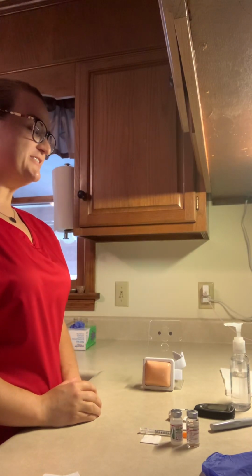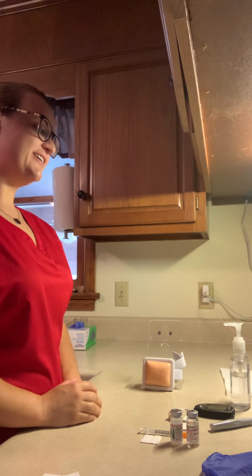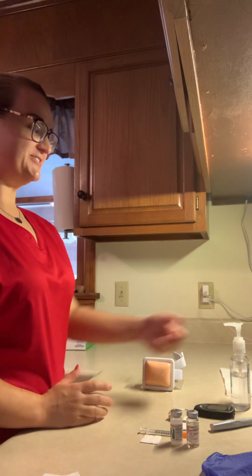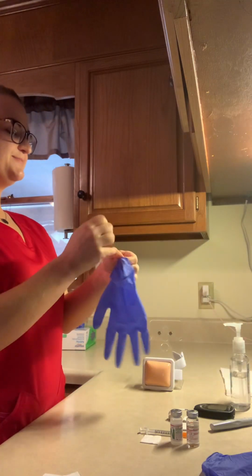Mr. Johnson, my name is Colton. Dr. Smith has given us an order to check your blood sugar and give you a shot of insulin. Do you mind verifying your name and date of birth for me? Great. So to get started, I'm going to wash my hands and put on a fresh pair of gloves.